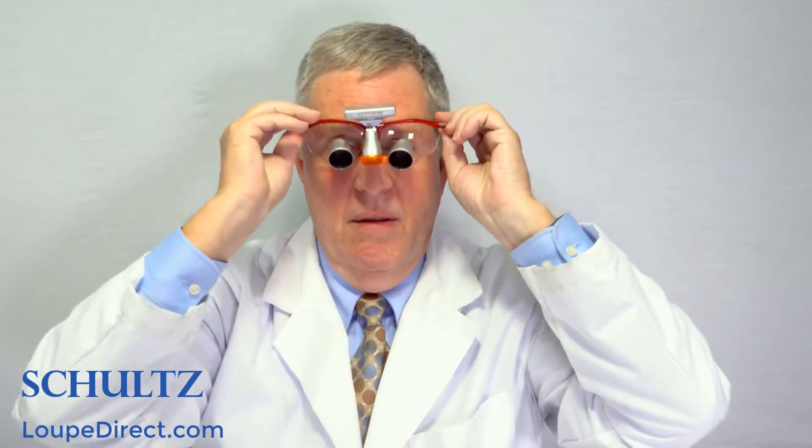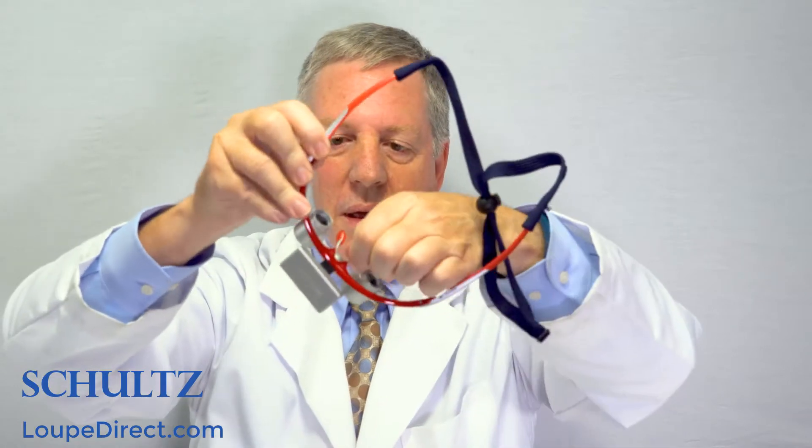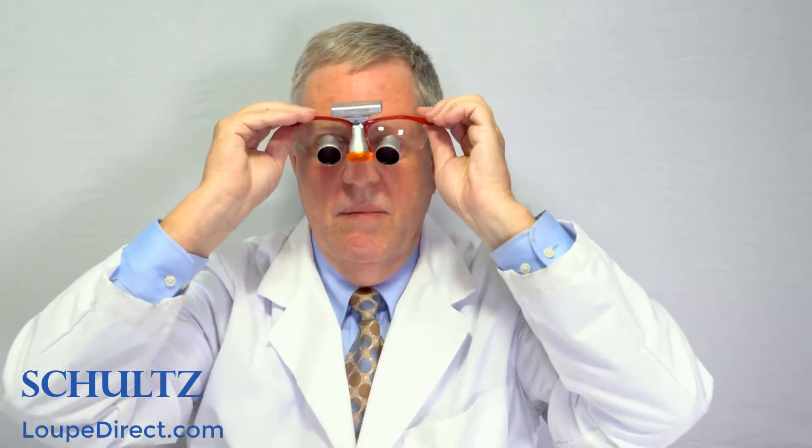Now try on the frames. You can adjust the nose pad to get the fit you need. Notice the quality of the frames and the feel on your face.